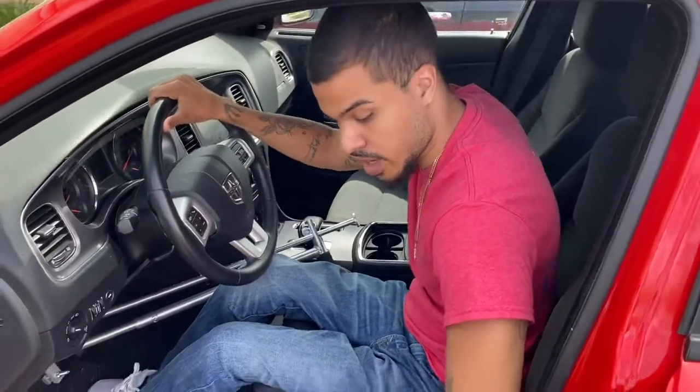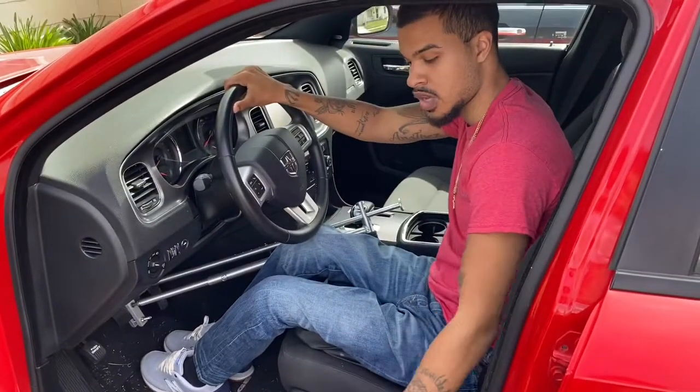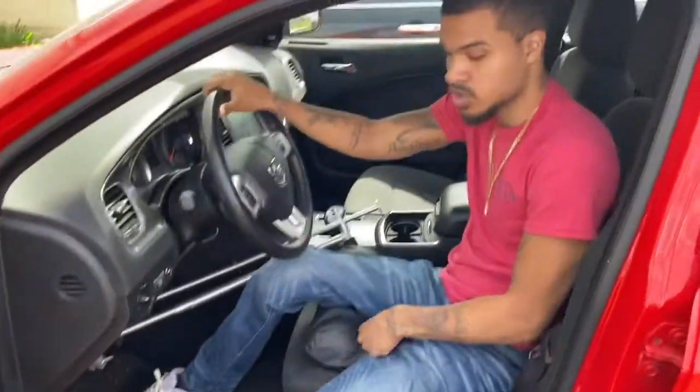Now I'm gonna show you guys how I get back out into the chair. Whenever you're getting back into the chair, you just got to pull the chair back up exactly where it was when you got into the car — so kind of at an angle. Just lean and put your foot over. It's the complete opposite of getting in, same thing you did to get in pretty much.